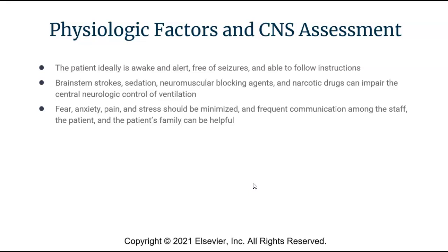Another big factor with weaning and extubating is there's going to be a lot of potential fear, anxiety, pain, or stress with this process. Many patients might remember how they felt prior to being intubated, and all of the fear of feeling like they couldn't breathe. That has to be so scary for them. So I try to be really reassuring when I'm doing my weaning trials. A lot of times I'll even start my patients a little bit higher on the pressure support, so when I switch them over, it's a lot easier for them initially, and it's not a big shock to their system where they're very anxious and concerned about trying the spontaneous breathing trial.